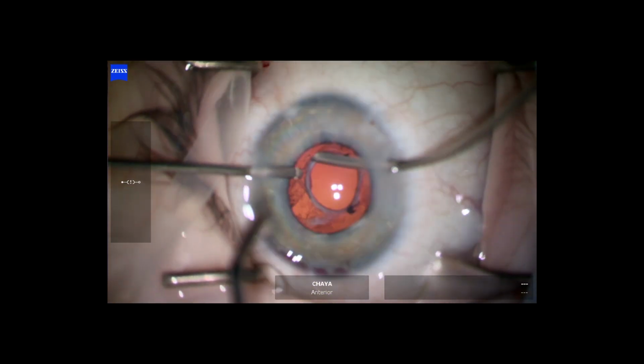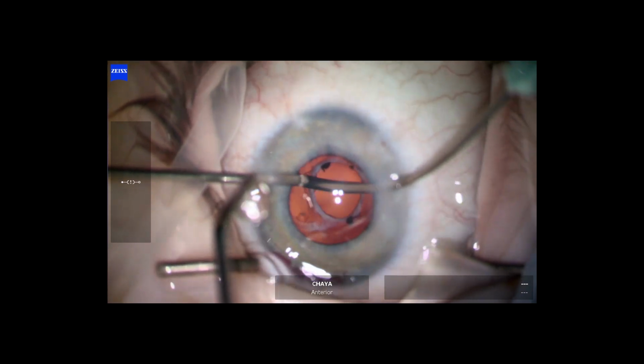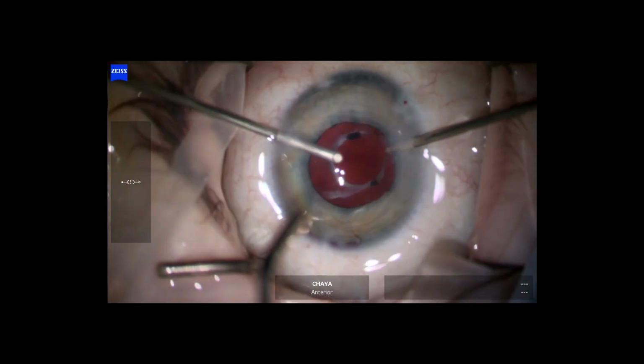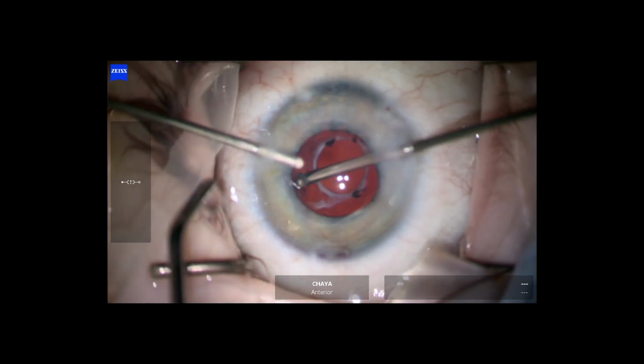However, that can be a bit risky in these cases as you sacrifice the stability of your central ring of fibrosis, and sometimes the thin peripheral capsule will tear when you're trying to push the lens posteriorly.